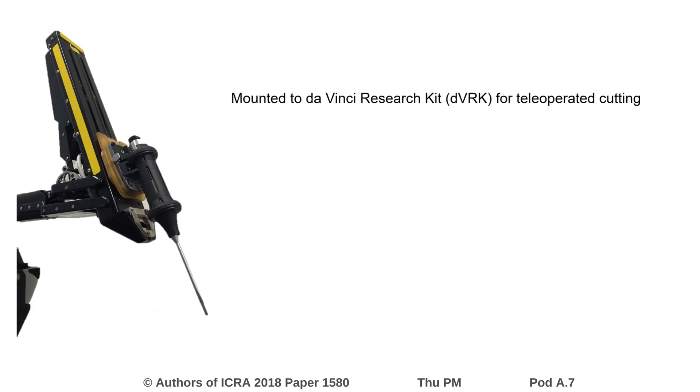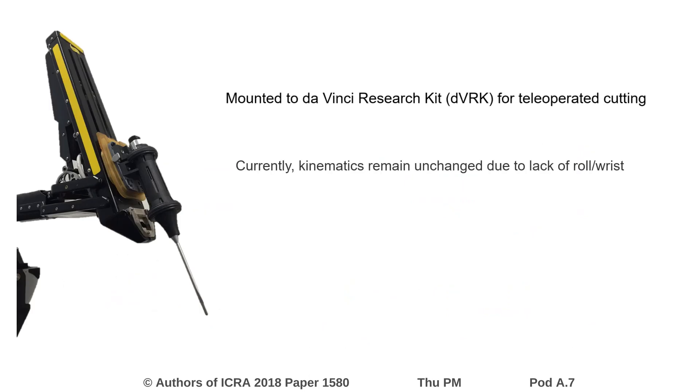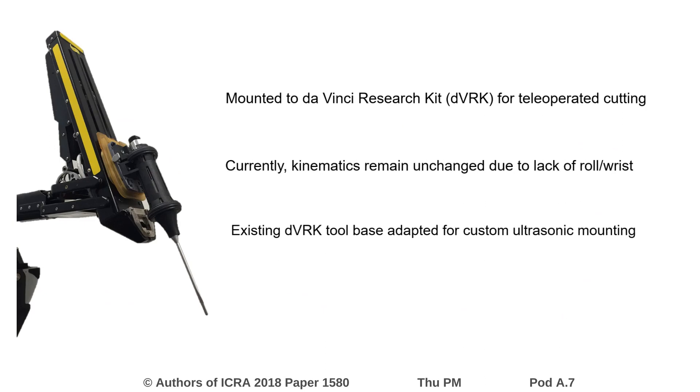After fabrication, the tool was mounted to a da Vinci research kit to test tele-operated cutting. The kinematics remain unchanged as the tool does not yet incorporate roll and is non-wristed. An existing DVRK tool base was customized for mounting the device.